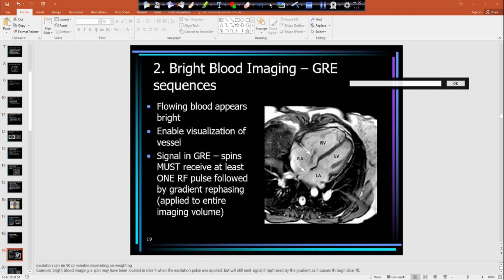What was the question? Which type of gradient echo usually creates a T1 weighted image? It's back when we were talking about gradient echo pulse sequence. It is commonly an incoherent, which is also called a spoiled gradient echo pulse sequence. So you're spoiling away that residual transverse magnetization. It creates a more T1 weighted image.